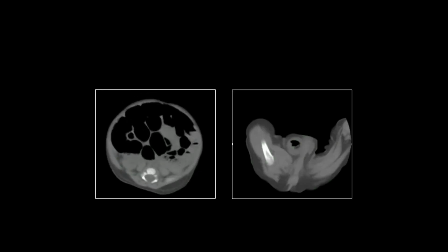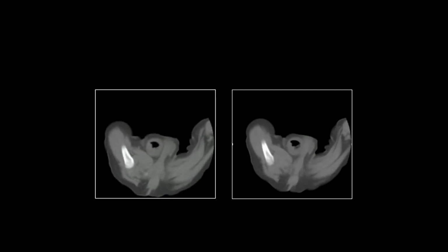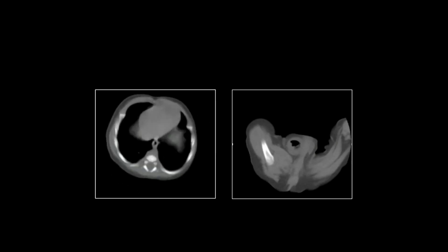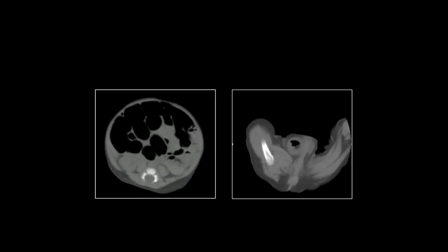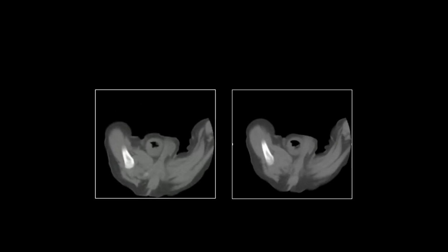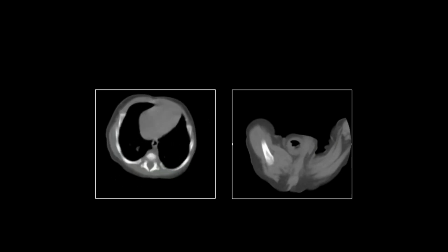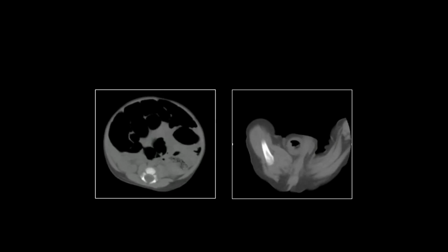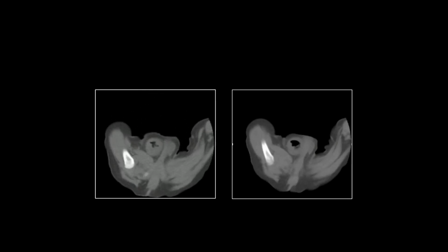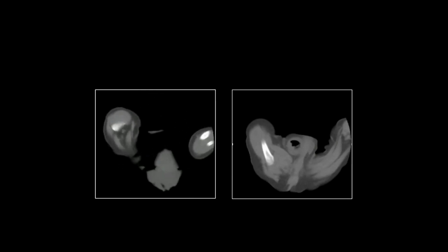So definitely a bowel obstruction, right? Look at all those dilated loops. And this is clearly in an infant as well. So when you see that, you're thinking, I think, three big things, right? It could be an intussusception. It could be a malrotation. And I think the other big thing to think of is a hernia, right?